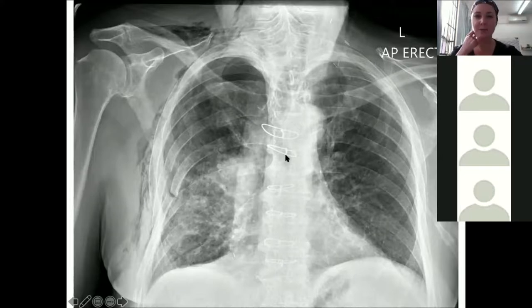So there's a question come through about the previous x-ray. If you suspect a spinal issue, would you prefer to do an overexposed x-ray? Yeah, 100%, because you want to have a look at the bones. So you'll probably find that that previous x-ray was, I would say, overexposed on purpose. Overexposed if it was a chest x-ray. If you're looking at your T-spine, absolutely perfect.